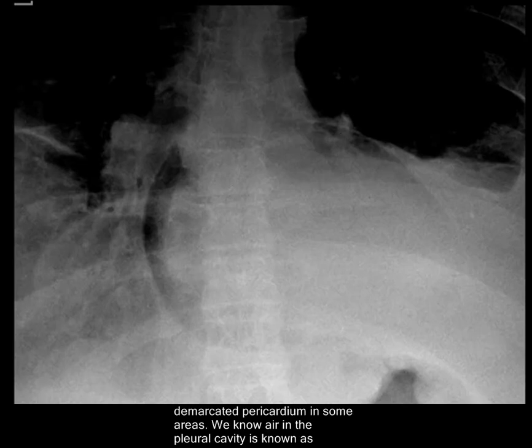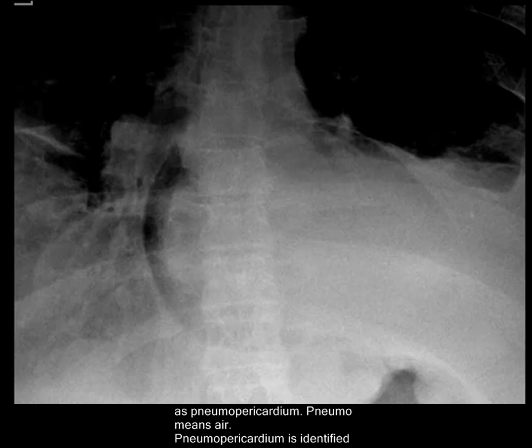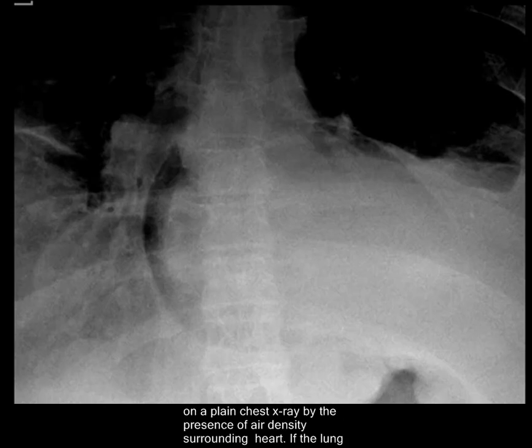We know that air in the pleural cavity is known as pneumothorax. Air in the mediastinum is known as pneumomediastinum, and air in the pericardium is known as pneumopericardium. Pneumo means air. Pneumopericardium is identified on plain chest X-rays by the presence of air density surrounding the heart.